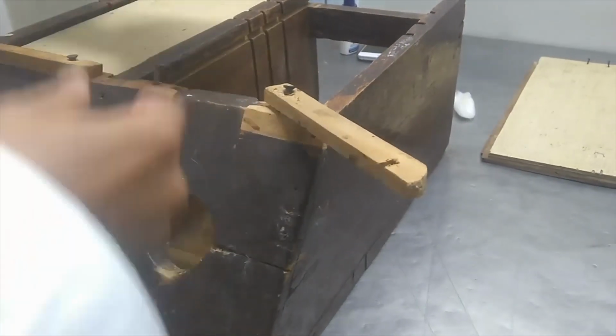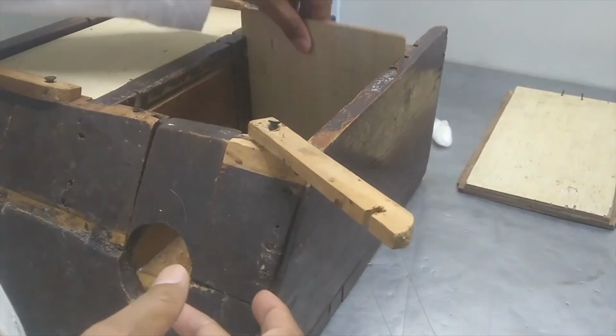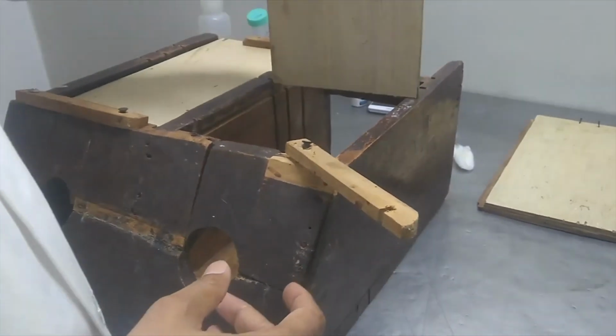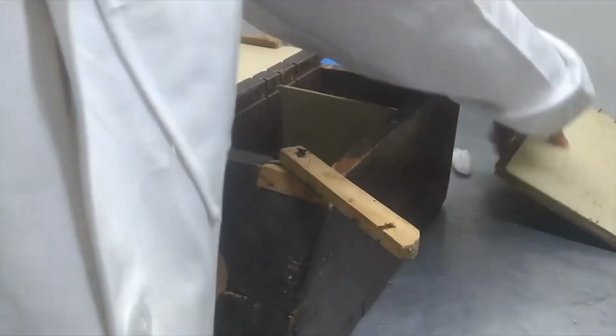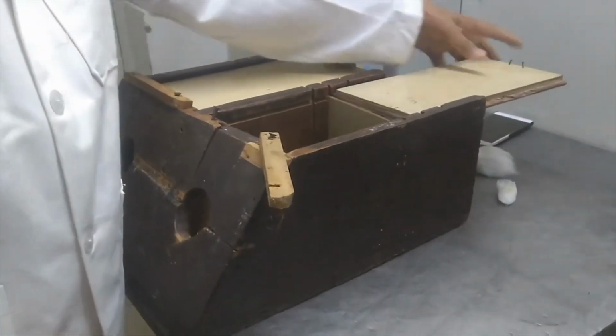Then we restrain the rabbit from the back side using these kinds of cassettes. According to the size of the rabbit, there are three slots given. And after using this, we restrain the animal from the top, like this.